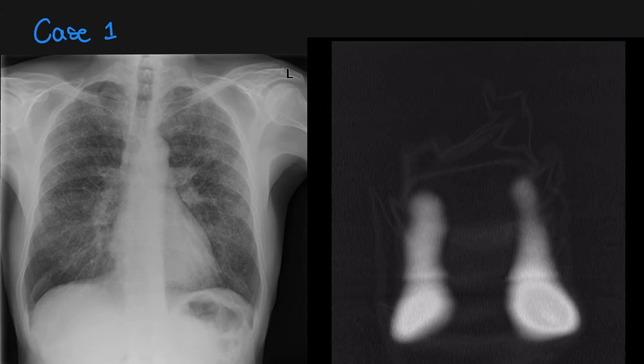Let's look at the first case. This is a 35-year-old male patient who presents with three weeks' history of cough. He has a history of heavy smoking. You can see that his chest x-ray is grossly abnormal. If you look carefully, you can see some cystic-looking areas, particularly in the upper lobes.